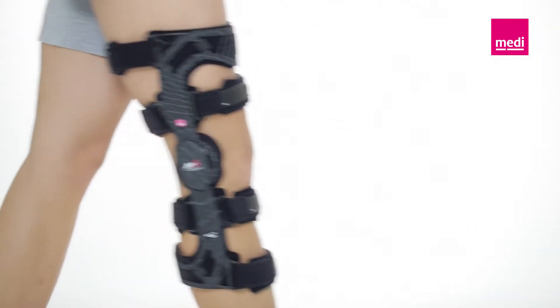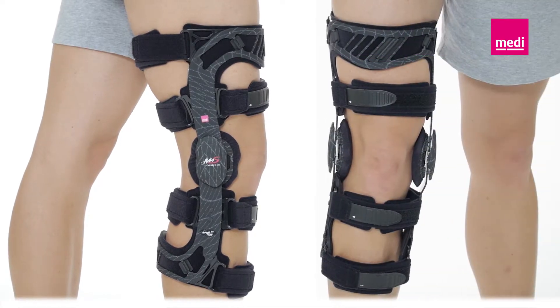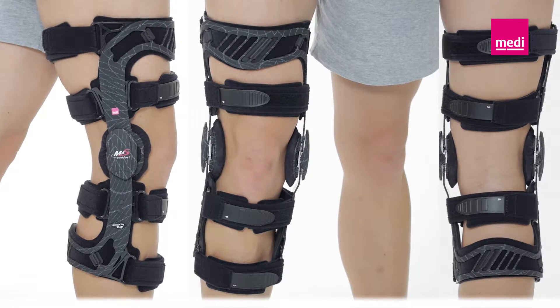The M4S Comfort is mainly used for ligamentous injuries in the knee joint. The knee brace ensures the necessary stability after surgery and during conservative treatment, especially in association with cruciate ligament ruptures.